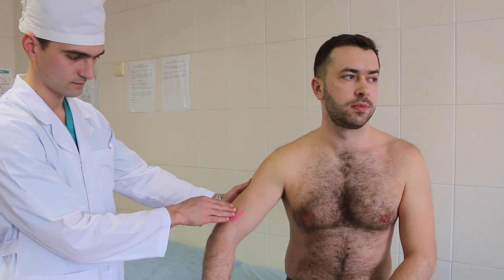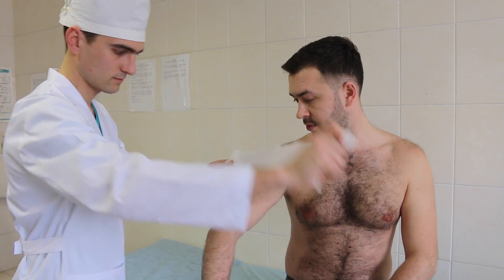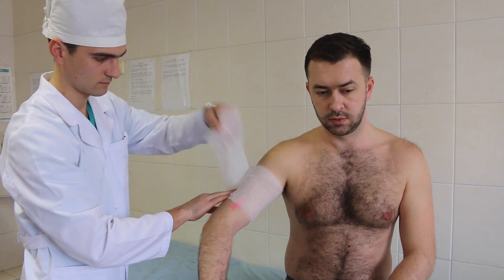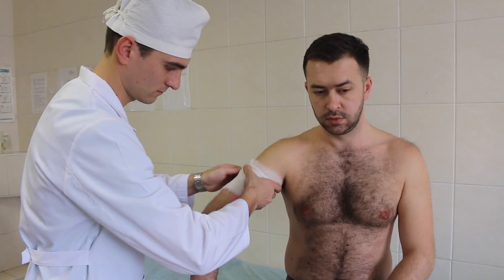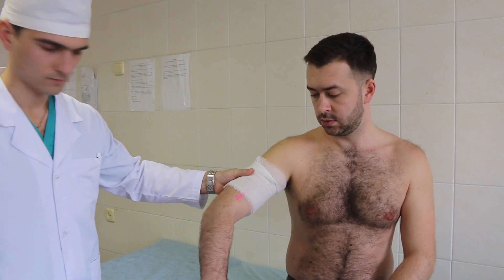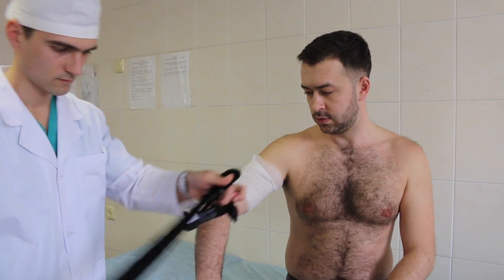In case of arterial bleeding, you should apply a tourniquet proximal to the wound. The tourniquet should have some padding underneath it to prevent skin damage, so use the victim's clothing, pant leg, shirt sleeve, or gauze to place under it if you can. Place your tourniquet about 2 to 4 inches away from the edge of the wound.